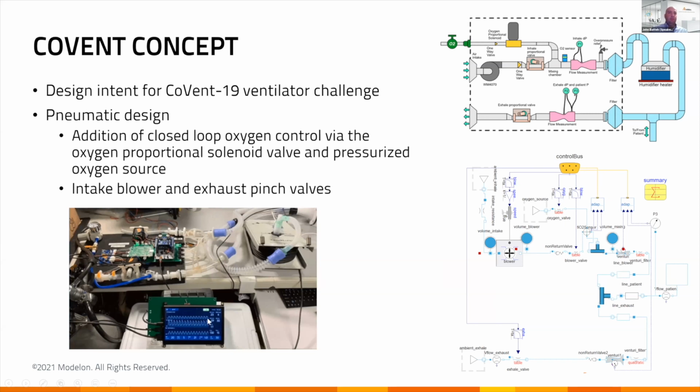And here's the way the actual system looks as it was built and tested. You can see all the various parts. This is what's called a quick lung. It's used to simulate the patient. And here you can see the display.